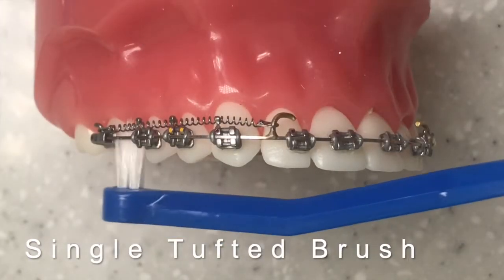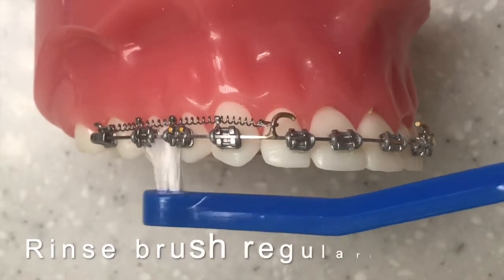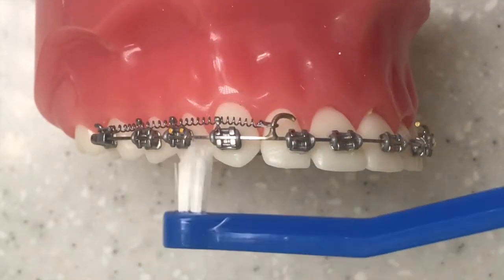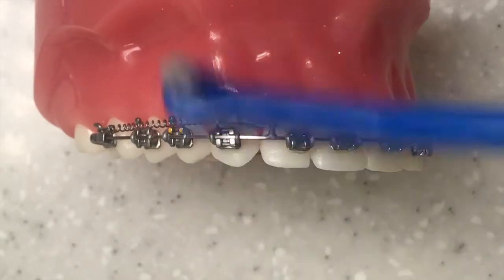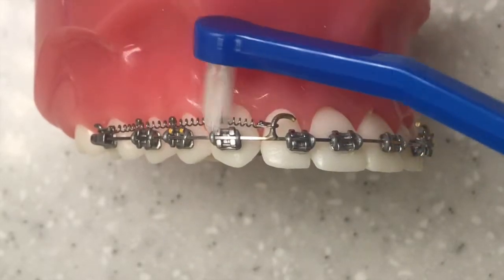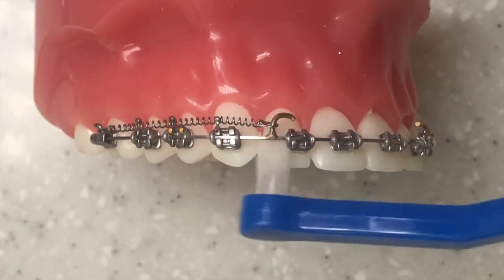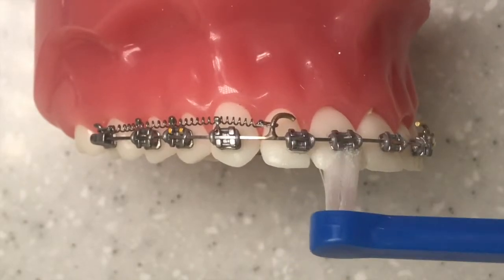Now we give you the small interdental brush — this is given at the start of treatment. You use this every day twice a day, going around each individual bracket underneath the wire, making sure you remove all that plaque and debris that can build up underneath your wires, in between your brackets, and around the little coils and hooks that you can see on the brace. Make sure you're working your way around all the way to the side, doing the same on the top and the bottom of every single bracket.